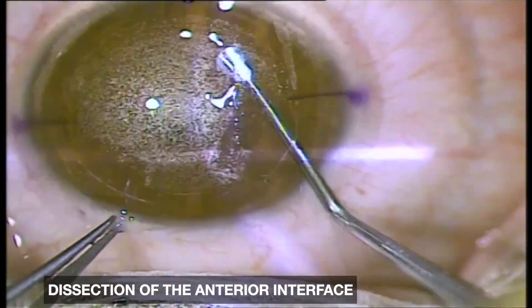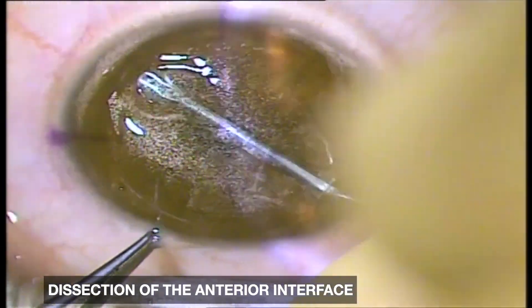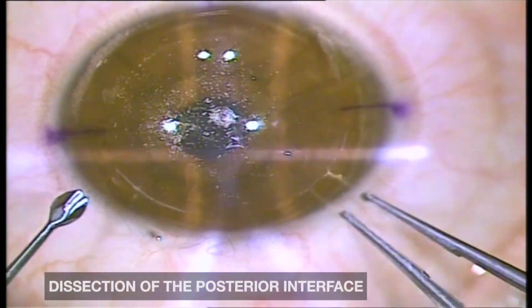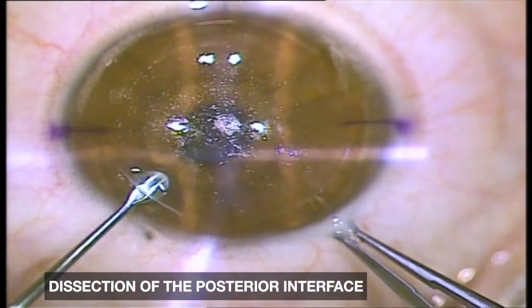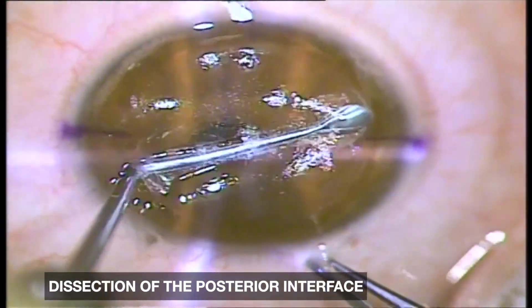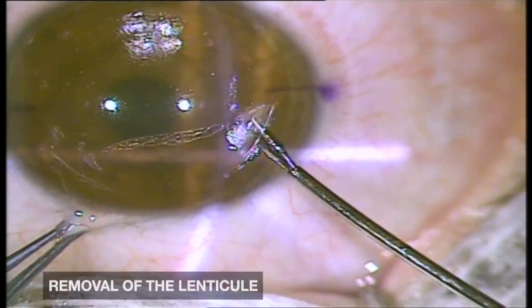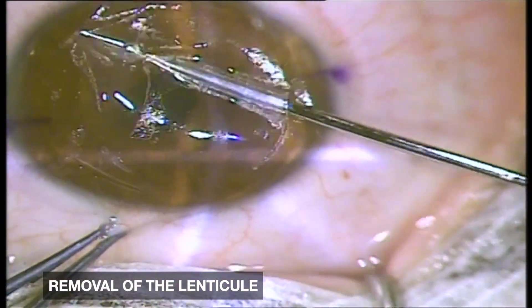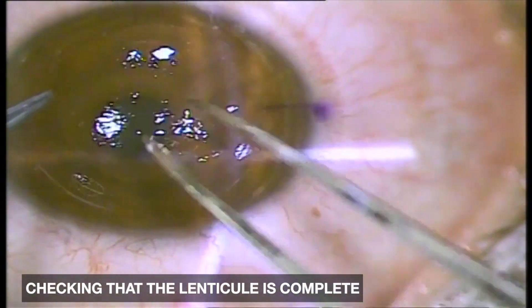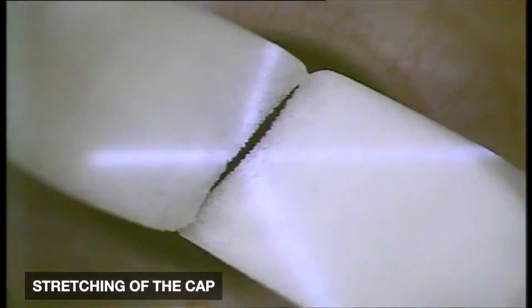Dissection of the anterior interface, followed by dissection of the posterior interface. Removal of the lenticule, then stretching of the cap.